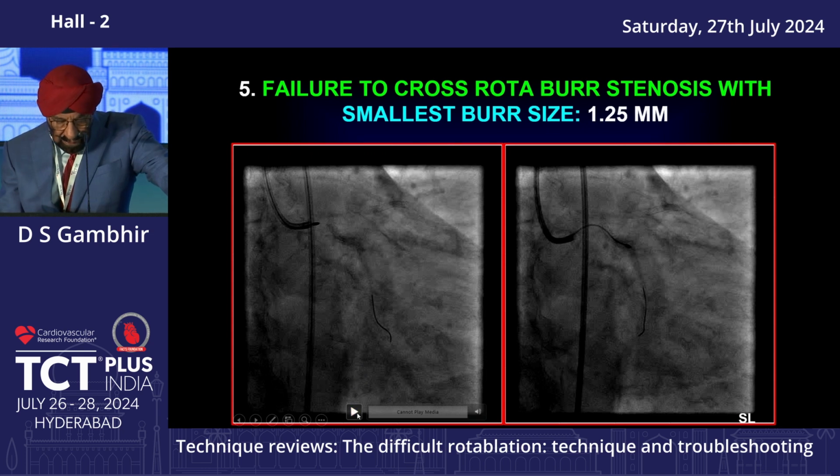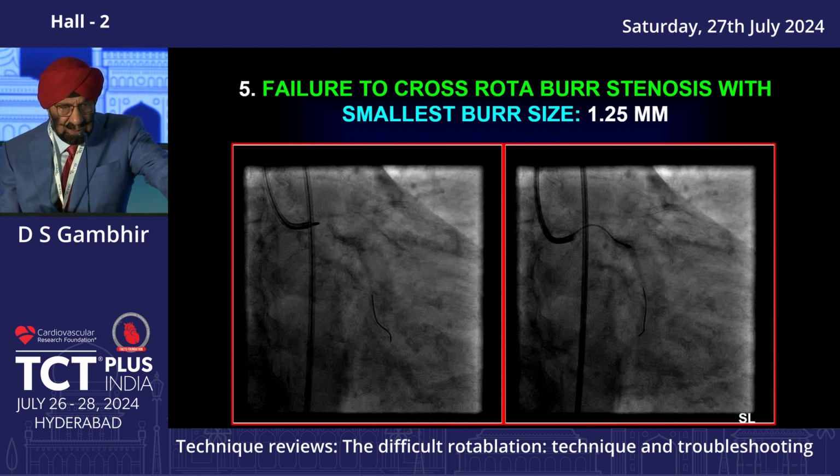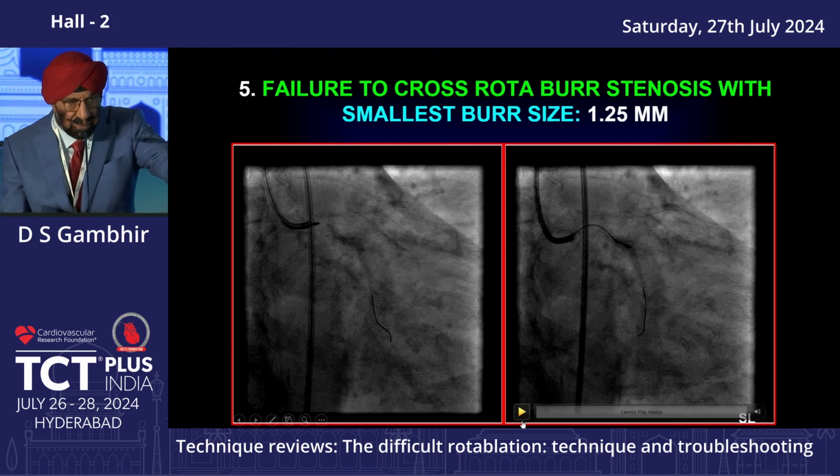This was a very interesting case which I showed you in my initial part of the talk. This lady had a stent deployed in Mysore, and for 1.5 years she kept on getting angina soon after the deployment of the stent, because the stent never got expanded fully, because at that time also the patient possibly had a fibrocalcific stenotic lesion. But the operator there didn't do any IVUS and just put in the stent, which did not expand.